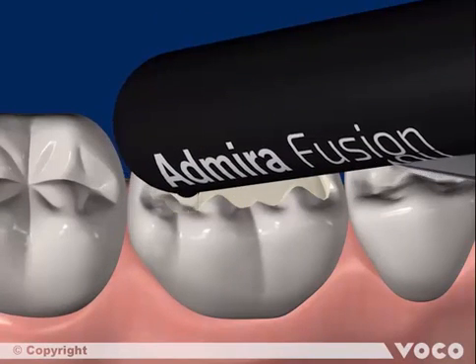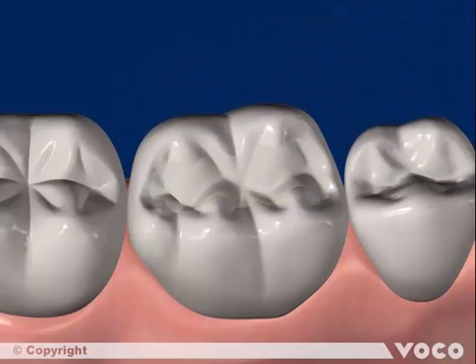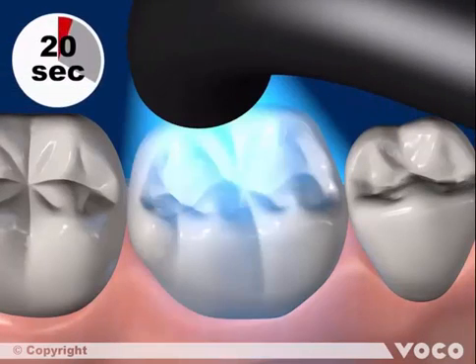The following increment is applied, adapted, and light cured again. Finally, the material is shaped, finished, and polished, resulting in a functional and aesthetic posterior restoration.